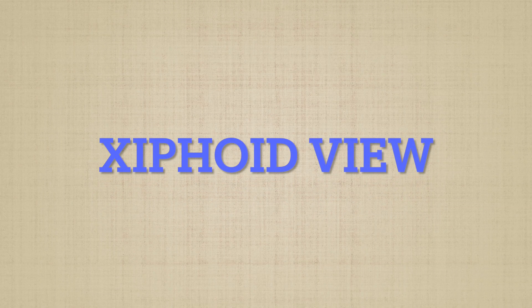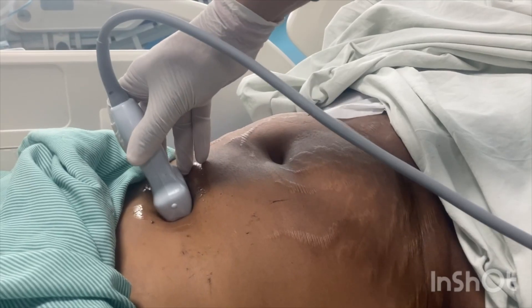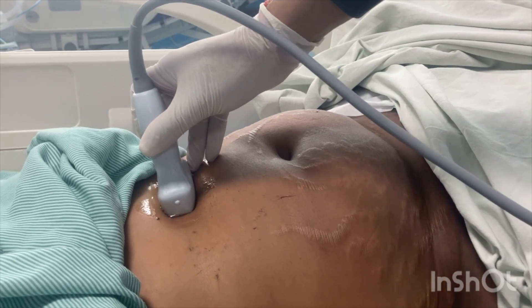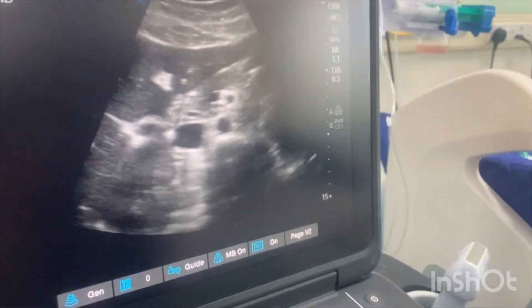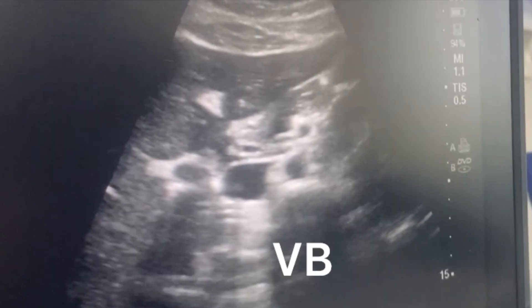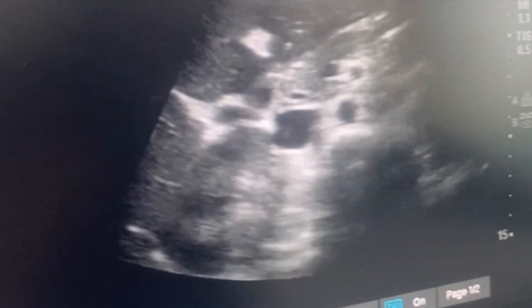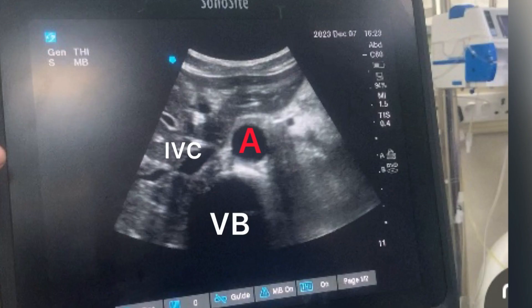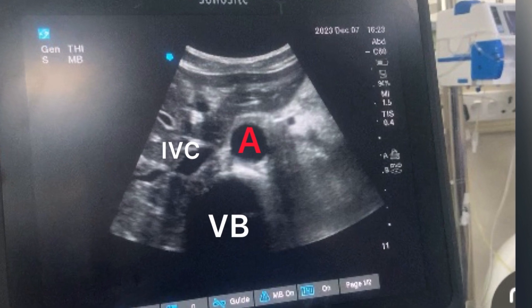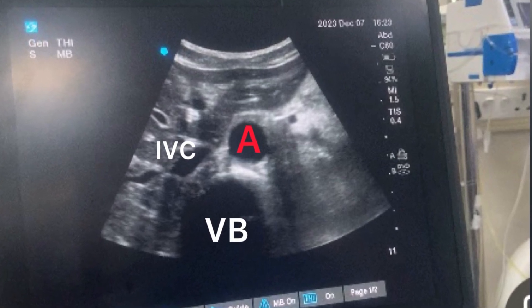Scanning technique — first is the subxiphoid view. In this view, you have to place the low-frequency curvilinear probe just below the xiphoid process. You will visualize the vertebral body, and a pulsating structure over it is the aorta, and just alongside the aorta you will see the IVC, as shown in this picture.